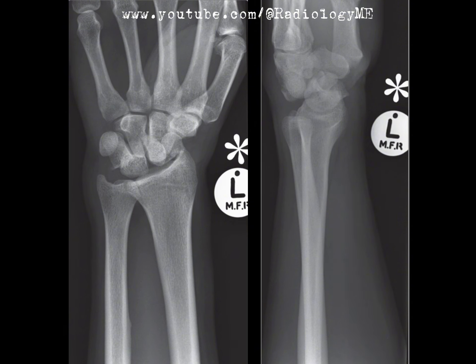From a radiological perspective, always take a moment to really evaluate the alignment of the carpal bones when looking at wrist films. On the dorsi-palmar view, you want to trace out Gilula's arcs — those nice smooth arcs of the carpal bones. Disruption of these arcs can signal dislocation or fracture. On the lateral view, the capitate should align with the lunate, and the lunate should align with the radius. Basically, everything should form a straight line.